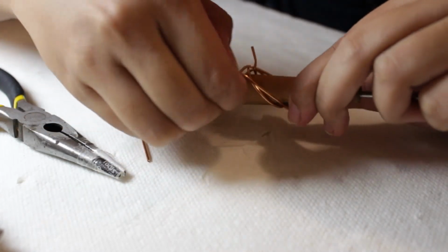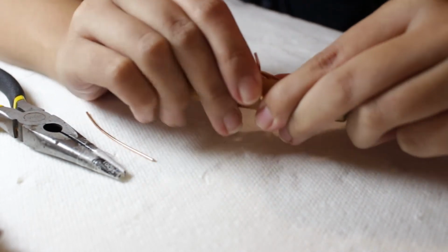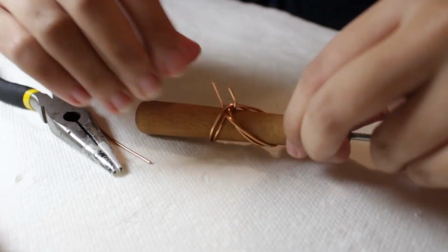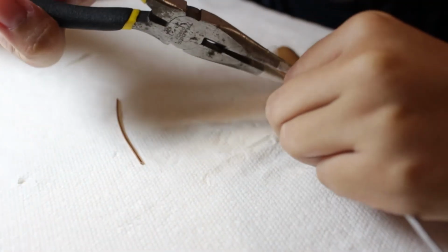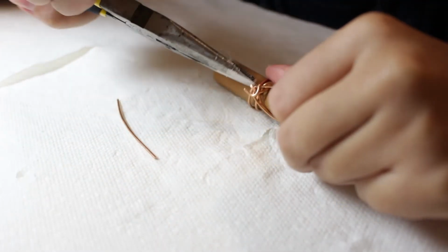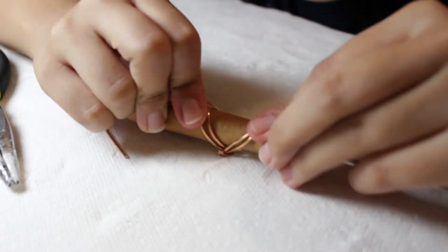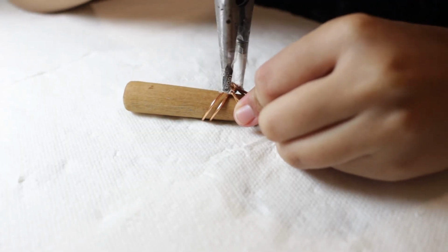Right about here, I've already cut the excess wire, and I'm going to insert the wire under the other wire just so that it would be more secure, and of course bend it upwards to lock it in place. Now it's time to clean up the ends of the wire, and I will do that by bending it to the side and turning it against itself using a plier. After that, I would just be pushing the knot against the table just to flatten it out and hide the sharp edges. Make sure there aren't sharp edges to ensure the comfort of the patient.